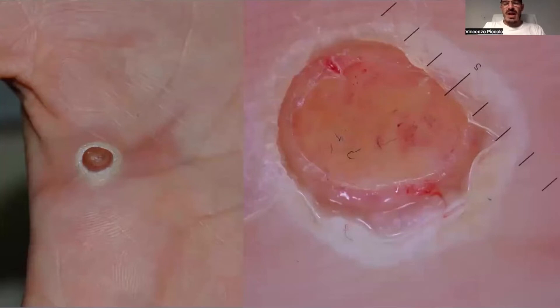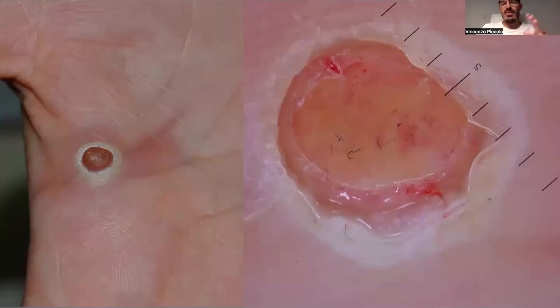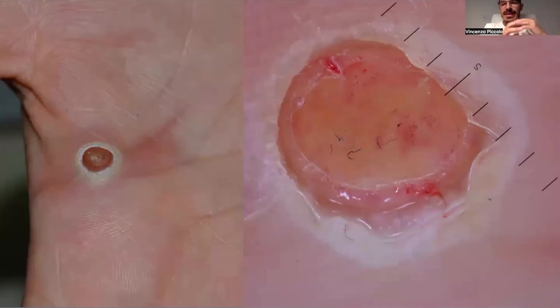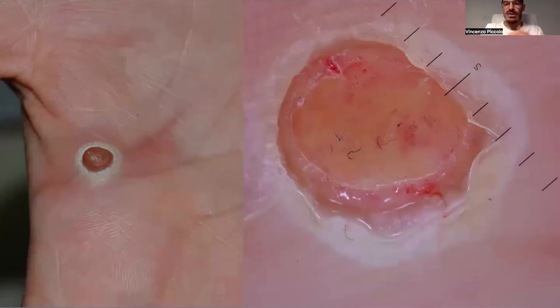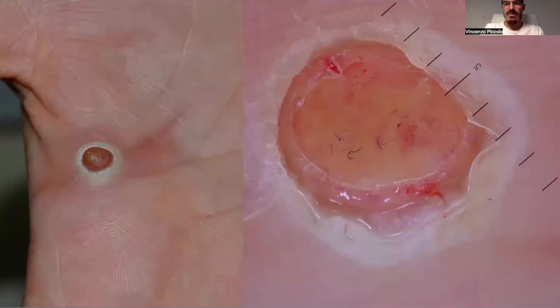Sometimes, more in adolescents or adults, we can see pyogenic granuloma on the palmoplantar region. In this case, the dermoscopic appearance changes. We can't see the red homogeneous lacuna.